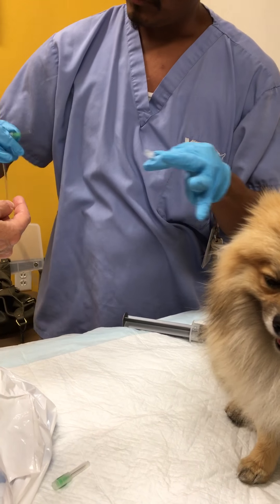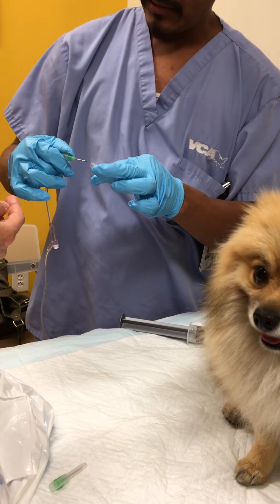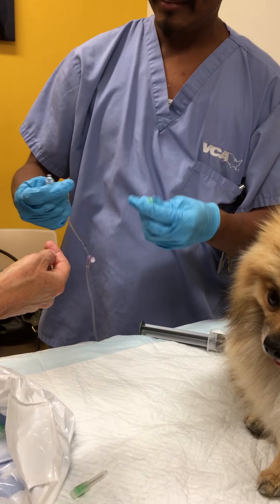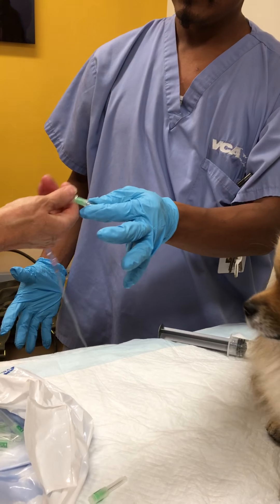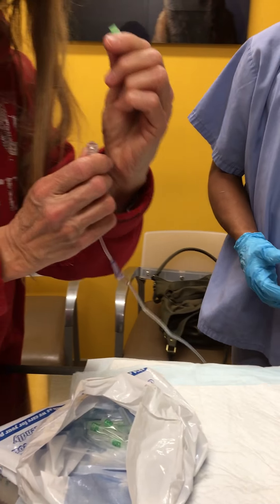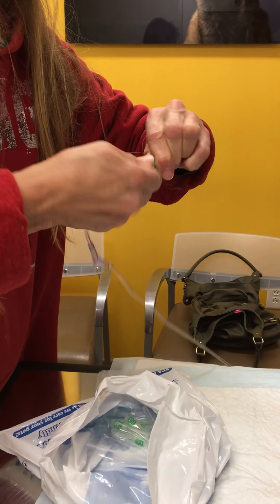If this is like this, you're not going to be able to remove it. The needle is going to stay in place. So remember, lefty-loosey, righty-tighty. Lefty-loosey, righty-tighty. Well, you're just a magician, aren't you? I've just been doing this for 14 years. Lefty-loosey and righty-tighty.